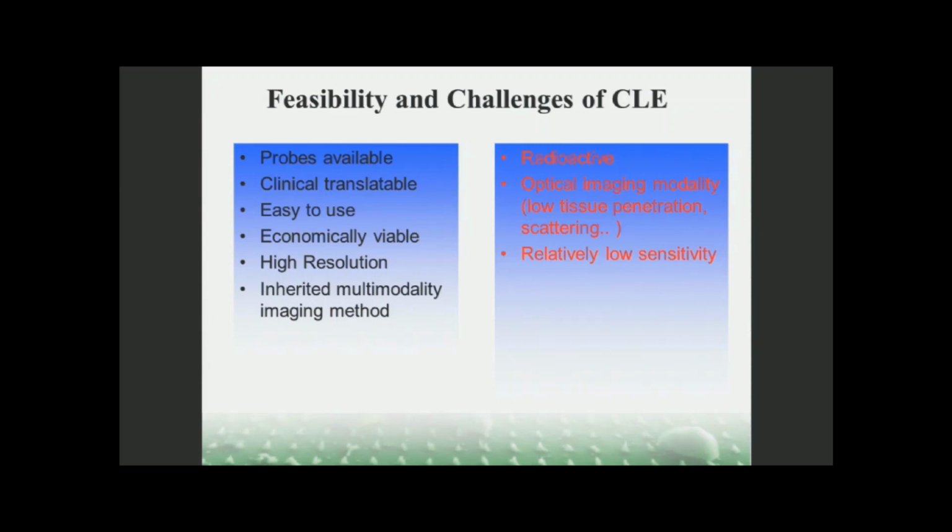You can do nuclear imaging, you can do optical imaging. If you label nanoparticles or fluorophores, you can also do optical imaging, or you can do several imaging modalities together. But the disadvantage is that they are still radioactive, and especially for the CLE system, right now the sensitivity is not as high as we wanted. We really want to push the detection sensitivity to the 0.1 or 0.01 microcurie level instead of the 1 microcurie we can achieve currently.